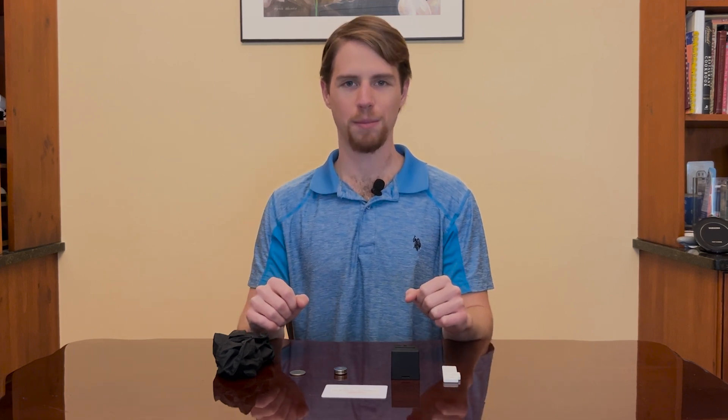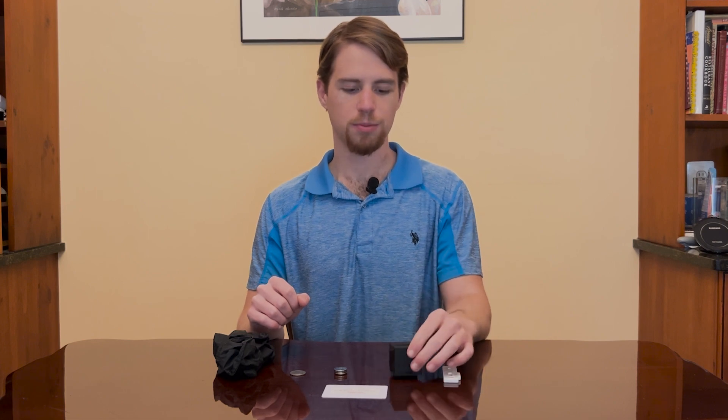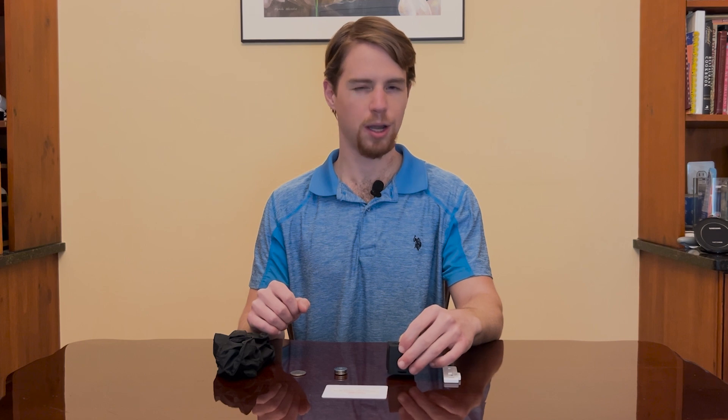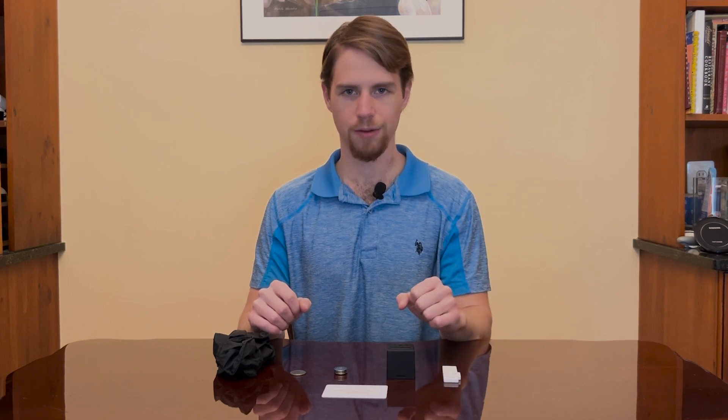Hey there. In this quick start guide, we're going to go over the black box reader digital meth residue testing device. This small mobile measurement device will help us perform a semi-quantitative and qualitative analysis of the AccuMeth test cassette. This is useful because it will help us determine a precise amount of meth residue that may or may not be present in the tested sample.